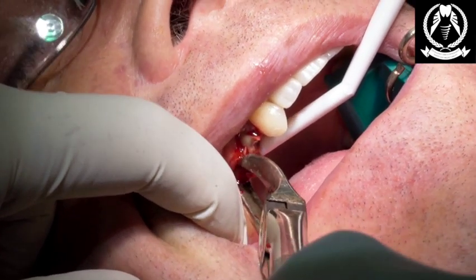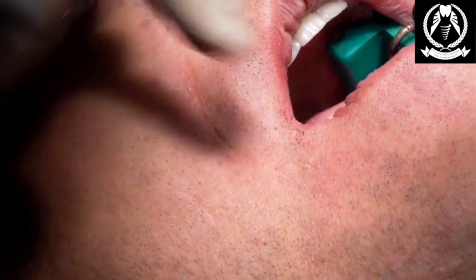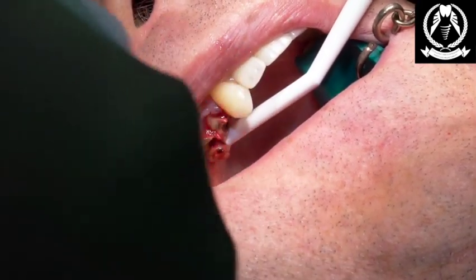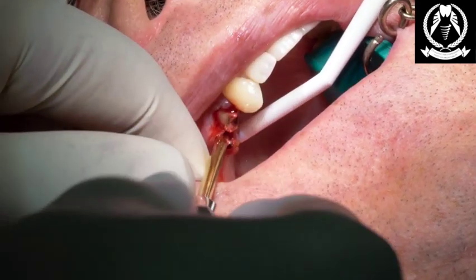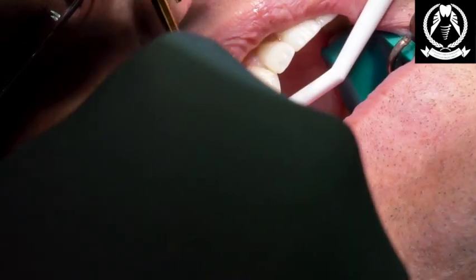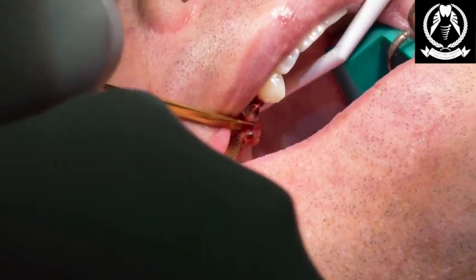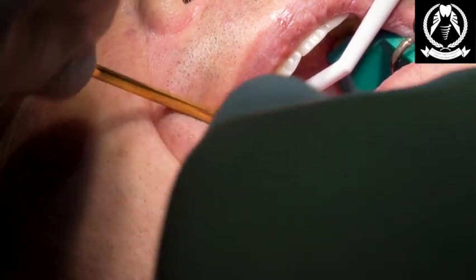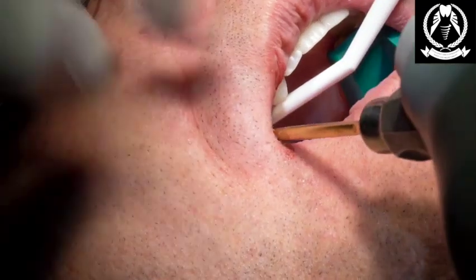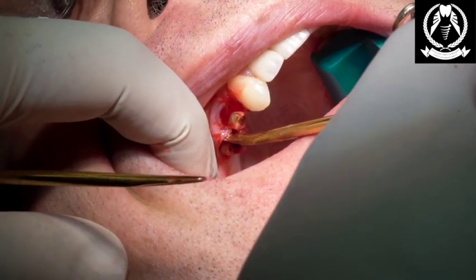Alrighty. So we're just easing it now, not forcing anything. And then we're just going to ease up a little bit more on the root. Okay, Marzena, can I have the wider luxator now, please? That's fine. Yeah. Okay, still working on that. Planing. Okay, tap tap. So a little bit more tapping now. Okay, Alan, well done.